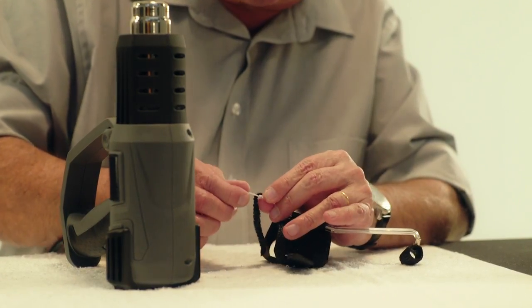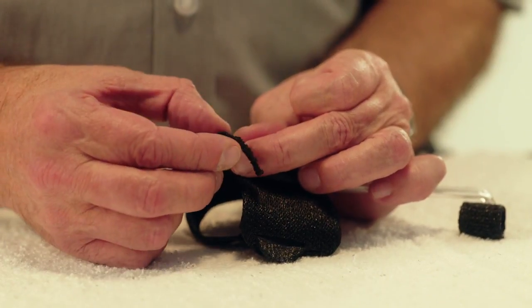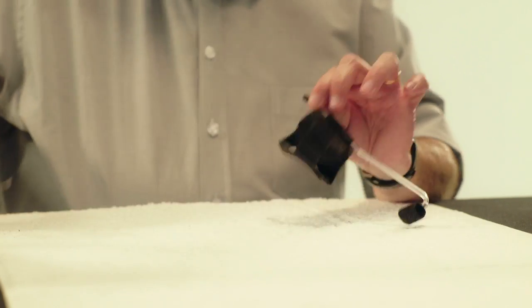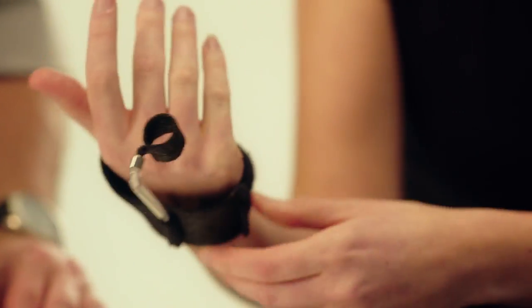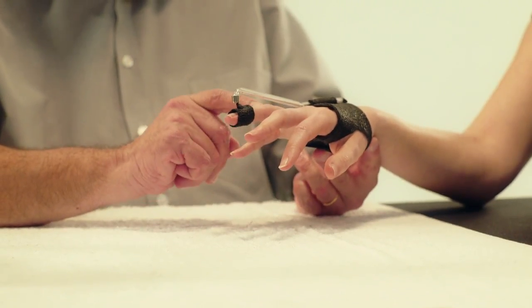Heat a piece of OrphiCast with the heat gun and roll this over the knot to secure the knot. The orthosis can be tried on. The finger is clearly pulled in extension.